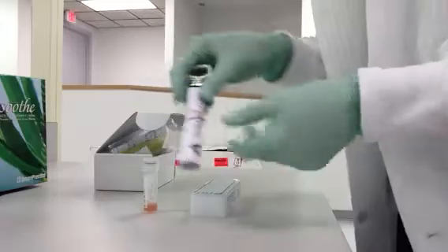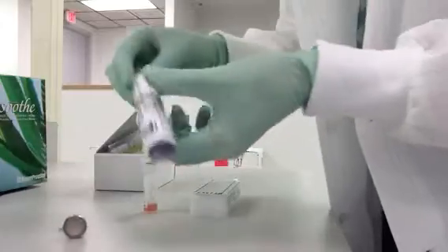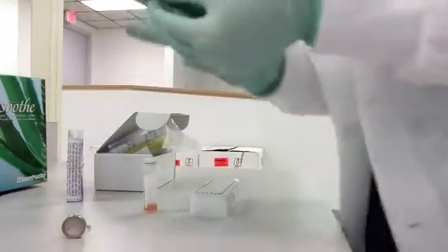We're going to show you how to use the capillary tubes to draw the sample. You're going to take this — this is the wire piston — and you're going to want to take one of these capillary tubes.